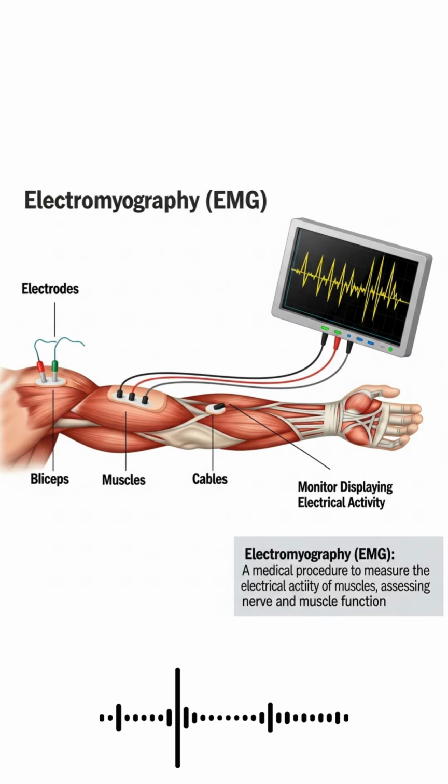This matters to us because when we watch someone perform a movement, we usually focus on the result. For example, how far a ball was thrown and how fast someone reacted to that. That's called a performance outcome measure, and it tells us what happened, but not exactly how it's happening. EMG just gives us a deeper look into that.